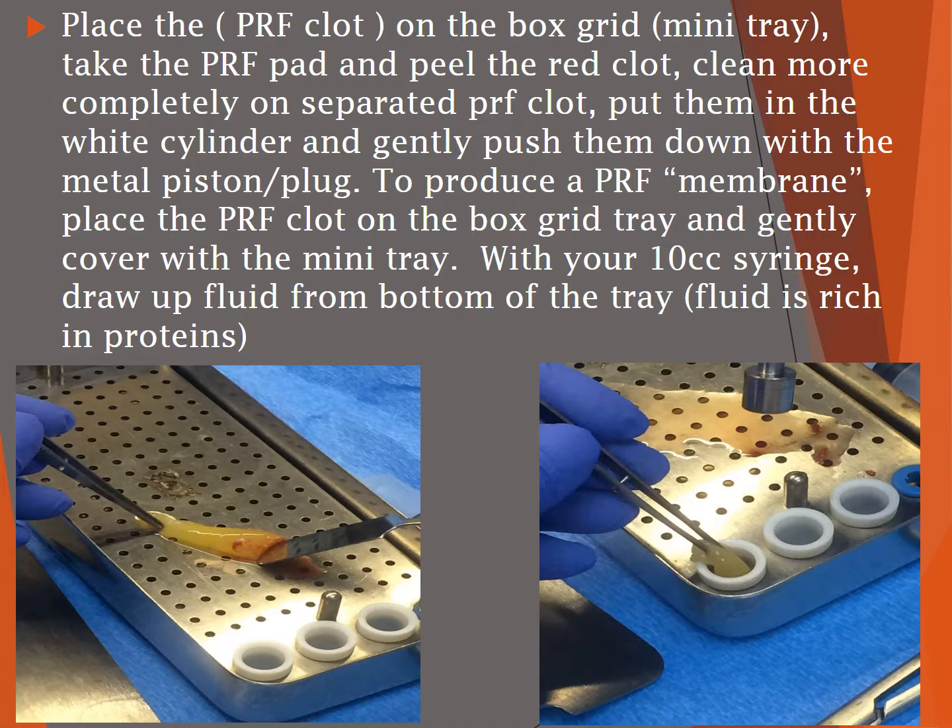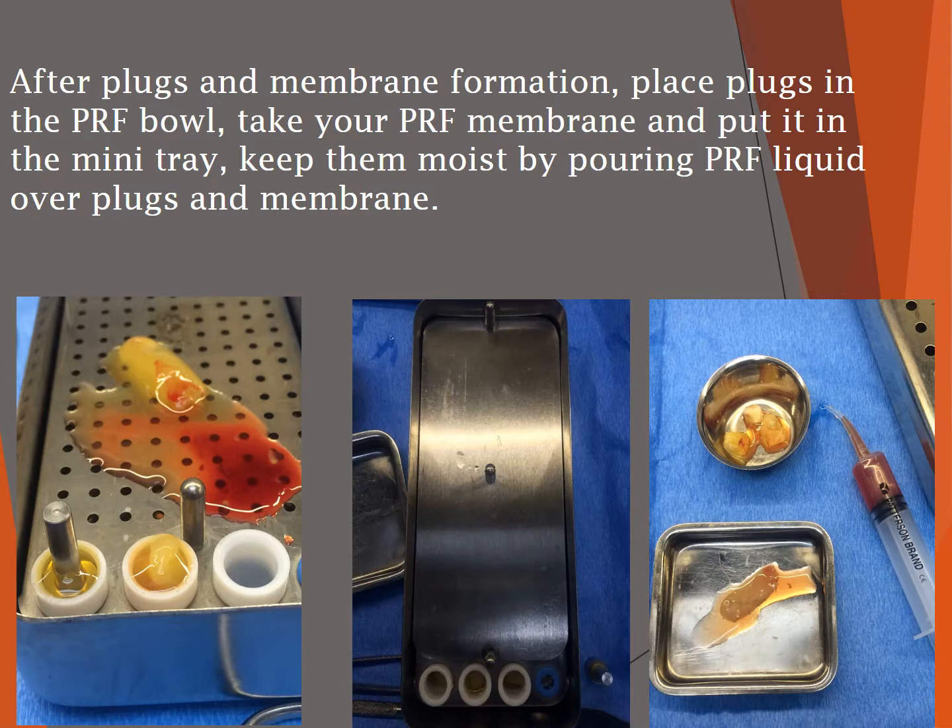Put the clots in the white cylinder and gently push them down with the metal piston plug to produce a membrane. Place the PRF clot on the box grid tray and gently cover with the mini tray. With your 10 cc syringe, draw up the fluid from the bottom of the tray — this fluid is rich in proteins. After the plugs and membrane are formed, place the plugs in the PRF bowl and put the membrane in the mini tray.